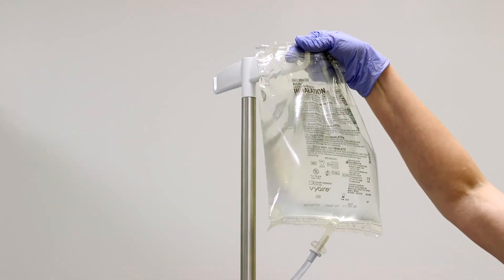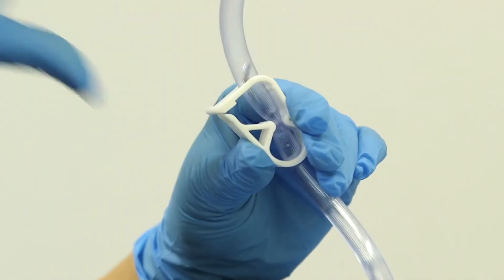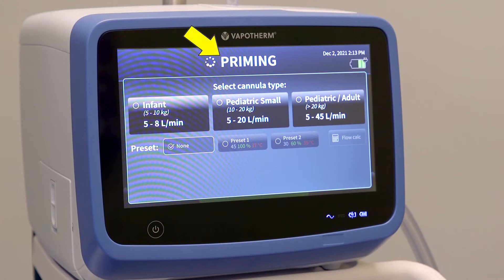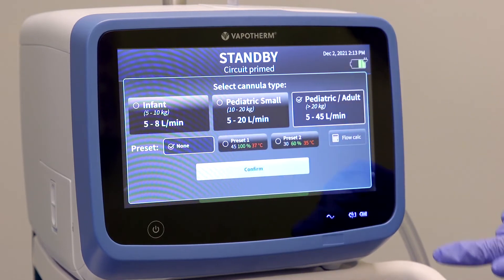Step 3: Hang and spike the sterile water supply, then ensure the tubing is unclipped to start the flow of water. The screen will show "Priming" at the top, indicating that the disposable patient circuit is priming with water. Step 4: Once priming completes, select the cannula type and hit confirm.